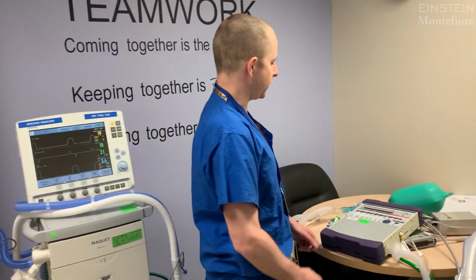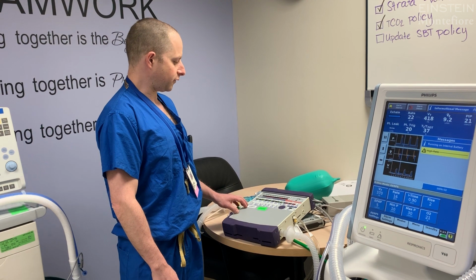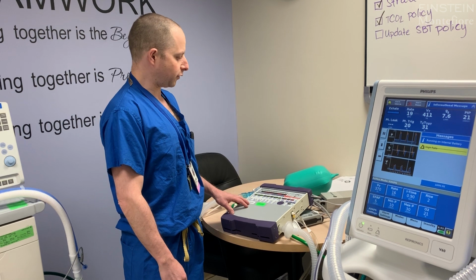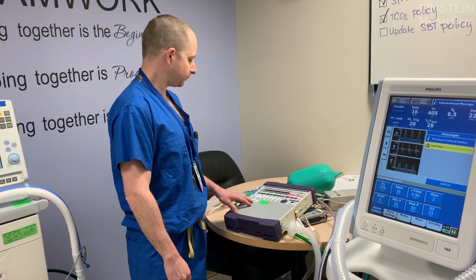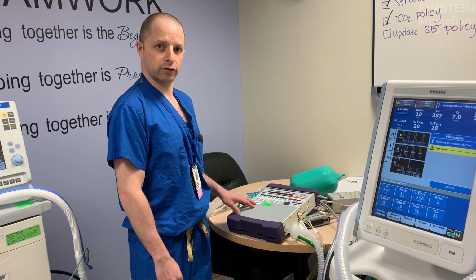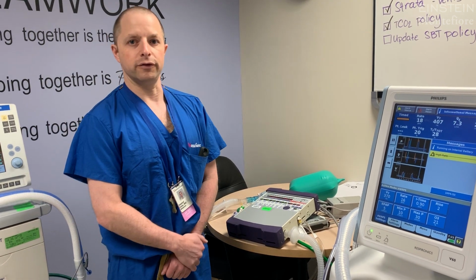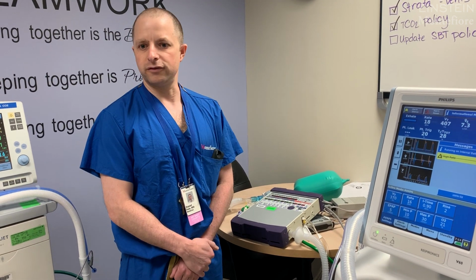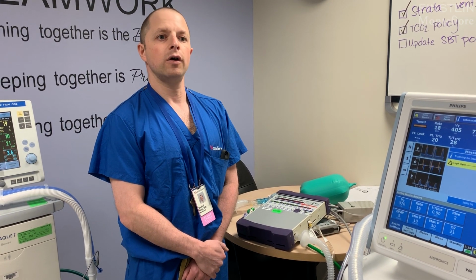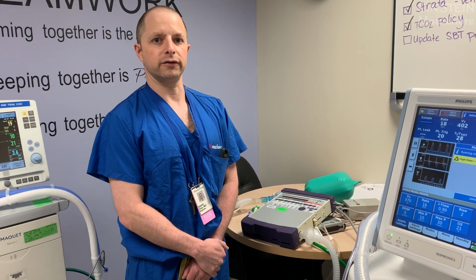The other type of ventilator we're more commonly seeing now is called an LTV ventilator. The interface is not as robust as the other ventilators, but it's a very capable ventilator that we're frequently using inside of our ICU. The most common setting that we're using for invasive mechanical ventilation is assist control, which traditionally is a very common type of ventilator mode that we use. What you do in assist control is you just set a tidal volume, and the patient either can trigger a breath and receive that tidal volume, or the patient is not breathing and the ventilator will deliver that tidal volume by itself.